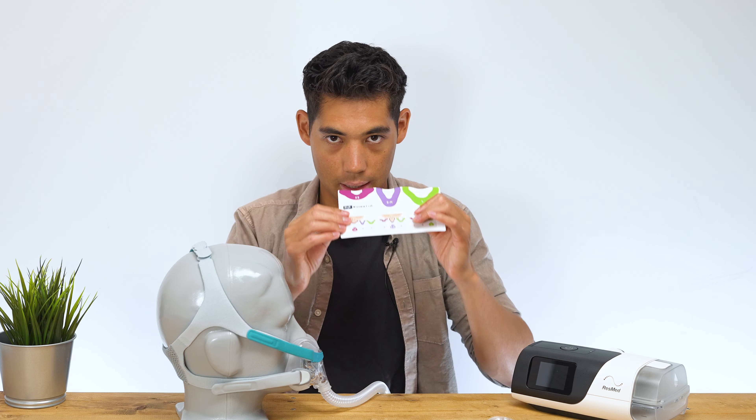The last point I want to cover is where the tube connects to the machine — something I mention in most CPAP reviews. People new to CPAP might wonder why some masks look so different from others, and that's mainly about where the hose or tube is positioned. With the tube at the front, you have the positive of not hearing the air rush on the side of your face. With something like the Dreamwear, a lot of air rushes through the side right beside your ear — it's not super loud but you can hear the vibration.